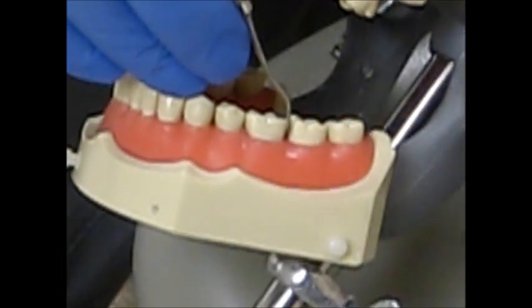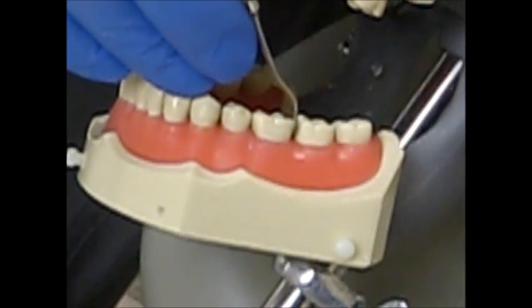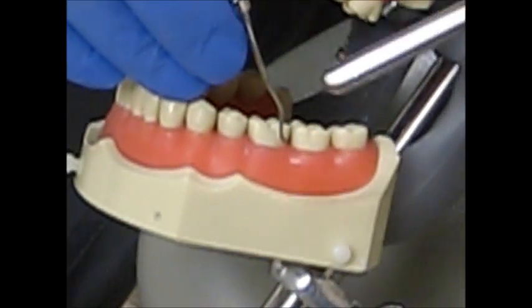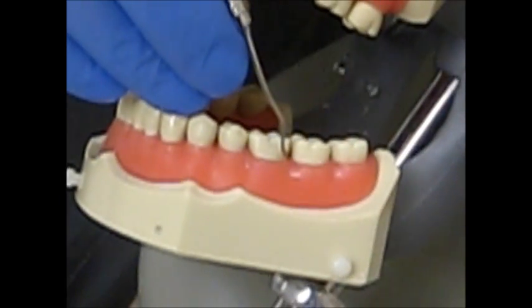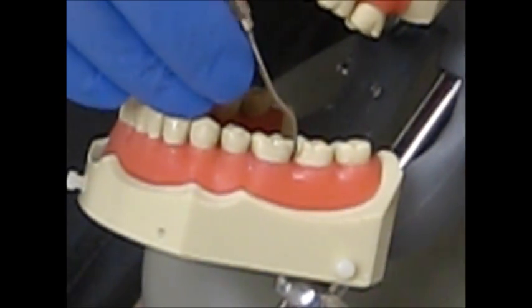You know you have the correct working end when the terminal shank is parallel to the distal surface and the last bend in the shank is away from the tooth going distally.